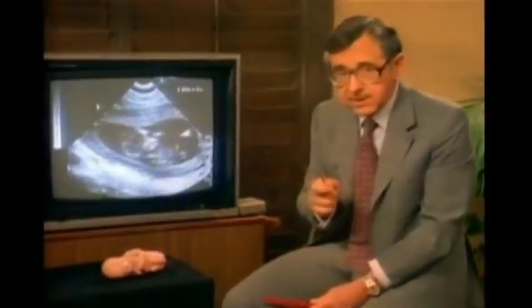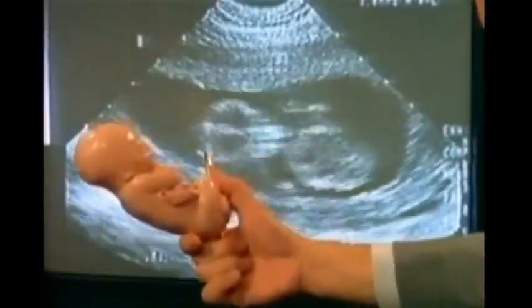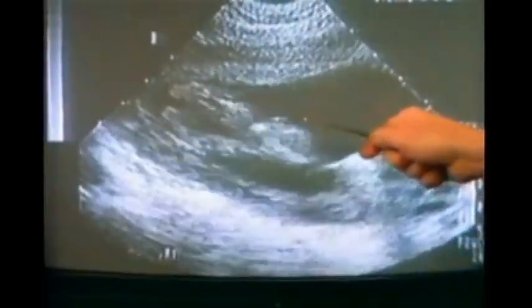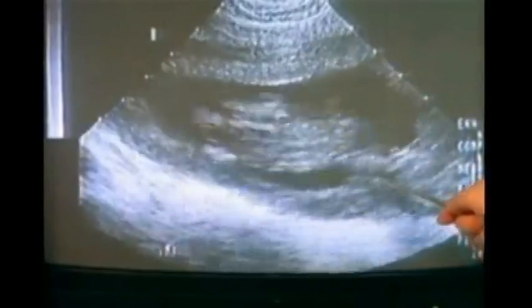Now, the suction tip has not actually touched the child, even though the child is extremely agitated and moving in a violent manner. The child has now moved back to the profile view, and the suction tip is flashing once again across the screen. The child's mouth is now open, and we will see that again on a freeze frame in a moment. But this suction tip, which you can see moving violently back and forth on the bottom of the screen, is the lethal instrument which will ultimately tear apart and destroy the child.